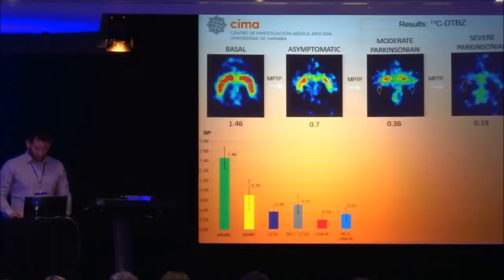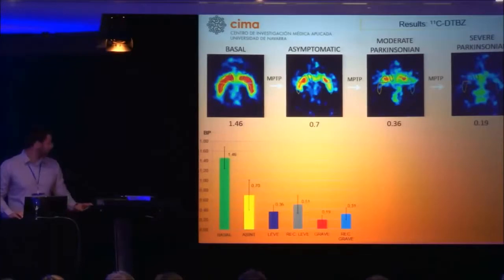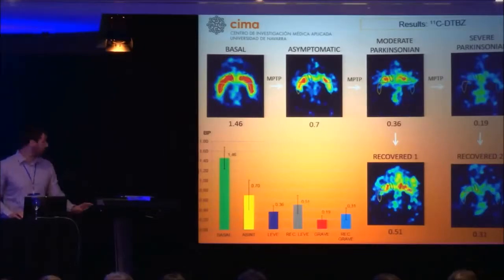These are the monoaminergic results. Parametric images showed a progressive decrease of binding potential values in the striatum throughout the ensuing of Parkinsonian signs in each state. Dihydrotetrabenazine predicts nigrostriatal lesion as established by histological correlation previously defined by Dr. Blesa in our group. It is remarkable that dihydrotetrabenazine PET images showed that a spontaneous motor recovery can occur in monkeys despite large dopaminergic striatal loss.